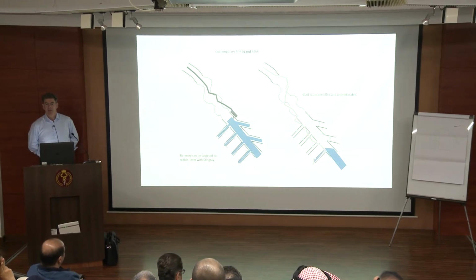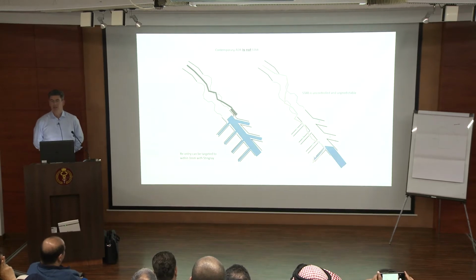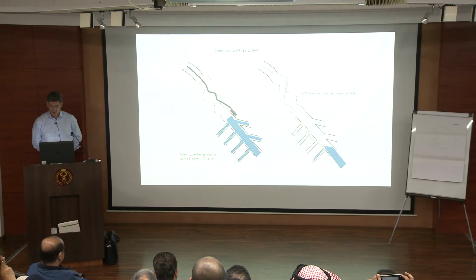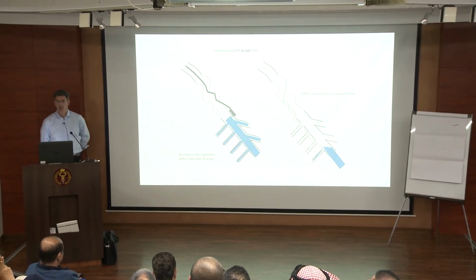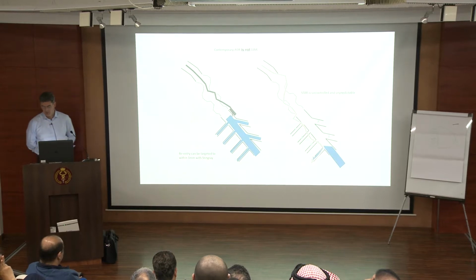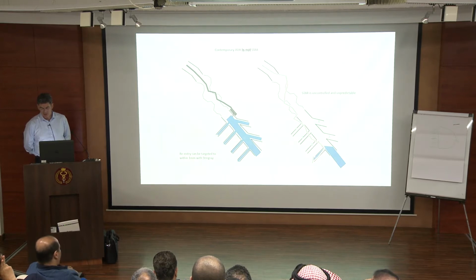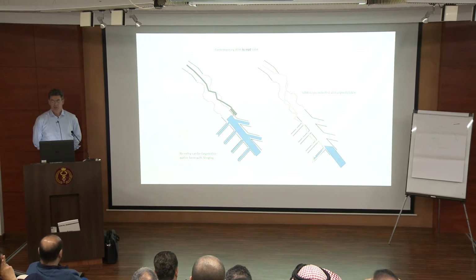The myth that people still hold in their heads is that this is like STAR, subintimal tracking and re-entry. The difference is that you can target your re-entry zone, and you're not losing the side branches. In the case you saw yesterday, we maintained all the side branches. We had a fairly precise and controlled re-entry before that bifurcation.